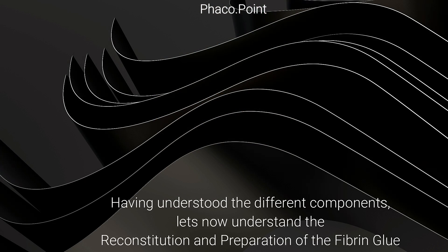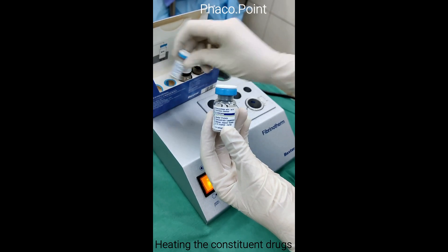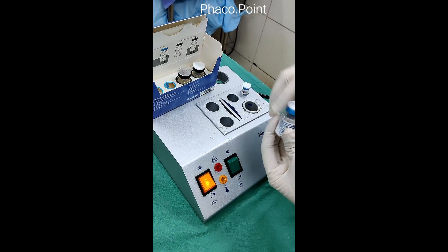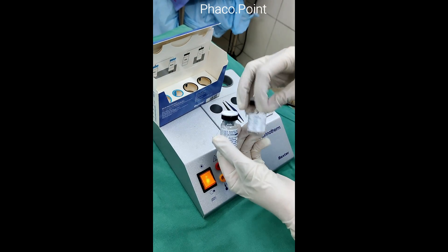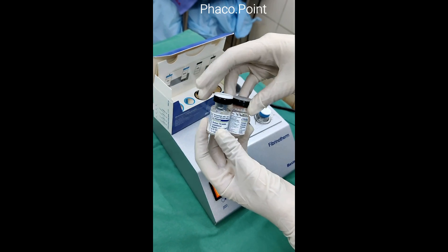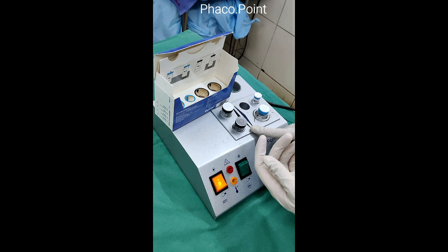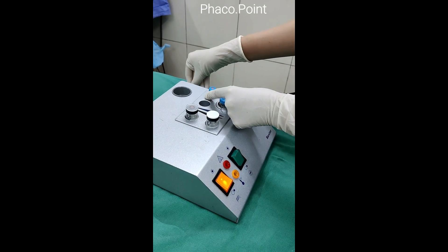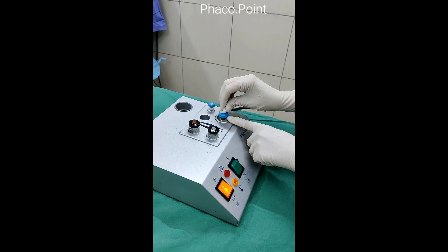We now see the actual reconstitution and preparation of the fibrin glue. The orange button is turned on to achieve the predetermined temperature of 37 degrees. The four bottles are placed in their appropriate slots in the Fibrinotherm for about two to five minutes to be preheated. Meanwhile, their covers are removed and the rubber sealants are cleaned with a non-iodine-based cleanser such as an alcohol swab.